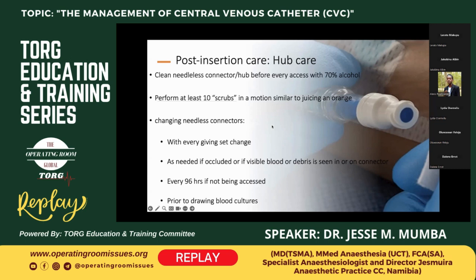There are other things that we need to do in the post-care. The question is, when do we change the lines that are connected? So we're saying that you change the giving set at least every 3 days. And in the case of where you have used a blood giving set, upon finishing administering the blood, we recommend that you clean the hub and you discard the blood giving set. In case you want to draw bloods from it, you still need to clean it with alcohol.